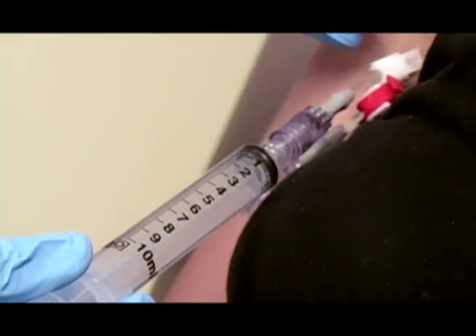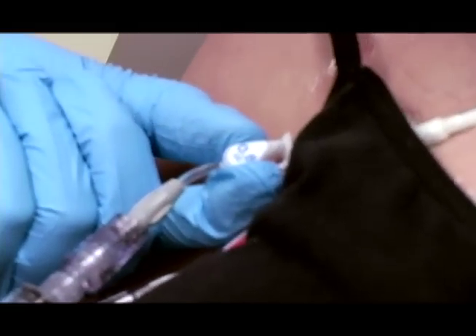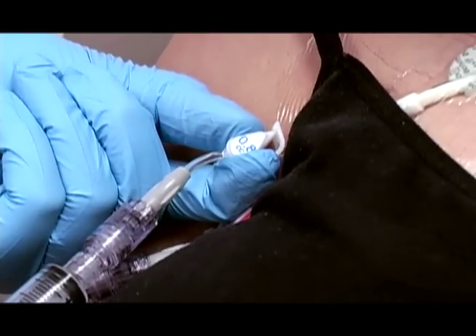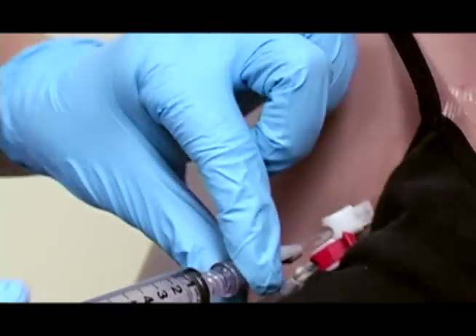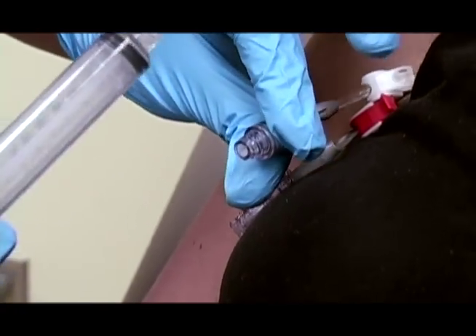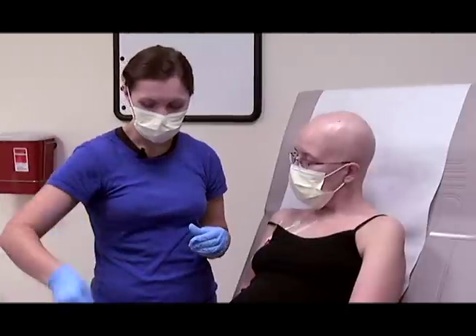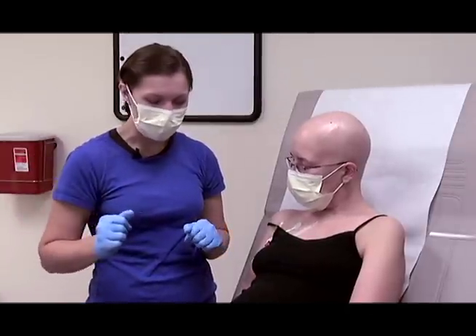When you're done, if you have a clamp on your line, close it. Remember, you will hear an audible click when the clamp closes. At this point, hold both the cap and the syringe. Gently twist the syringe in a counterclockwise direction until it comes off. Be sure to throw the used syringe in the trash.